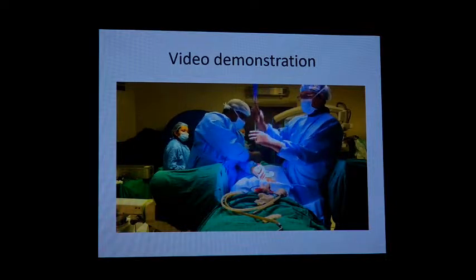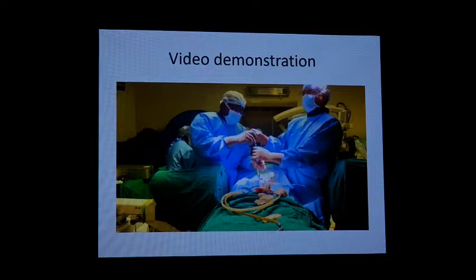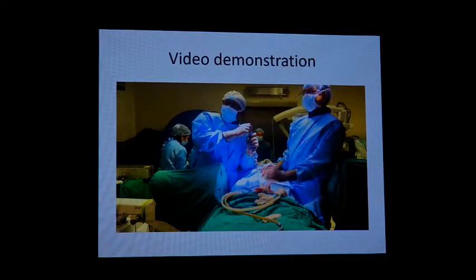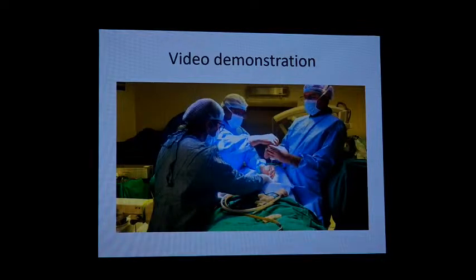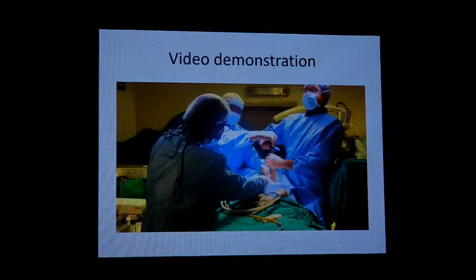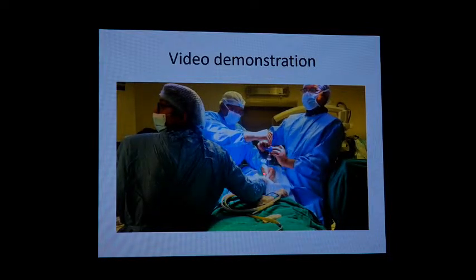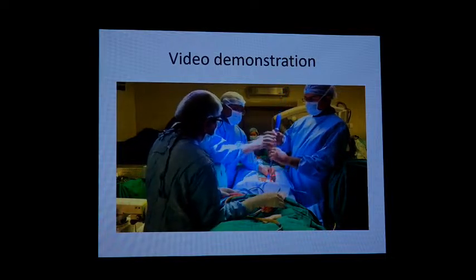You have to remove the first and second dilator. The screw will follow the path that you have created, so there is no necessity for you to keep on tapping. The same procedure is repeated on the opposite side. See, attention is paid to the K wire so that it doesn't migrate. Using a ratcheting handle, you can easily deploy all the screws.